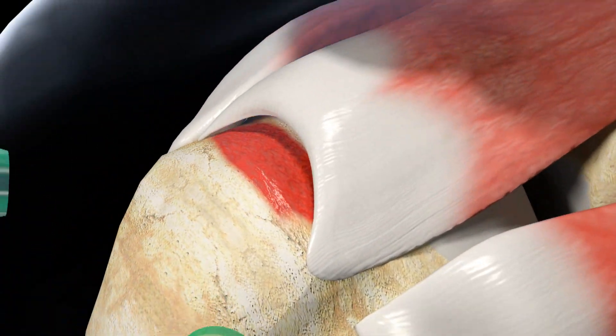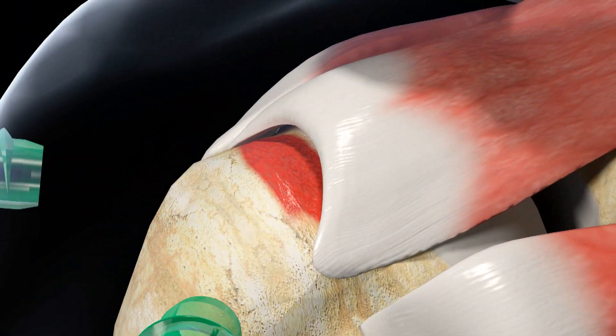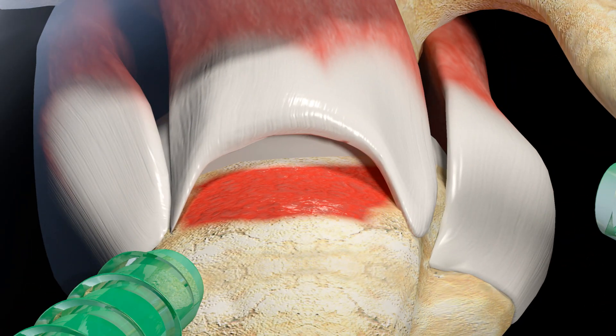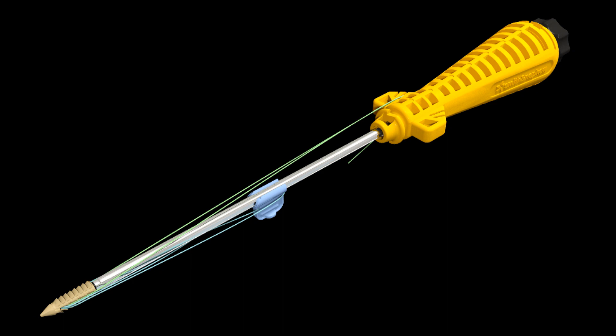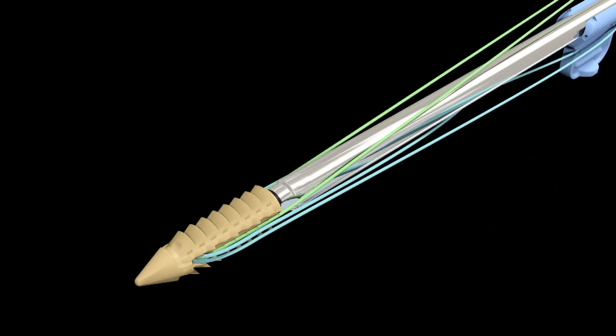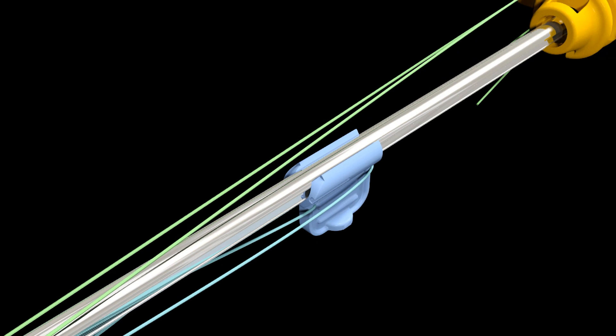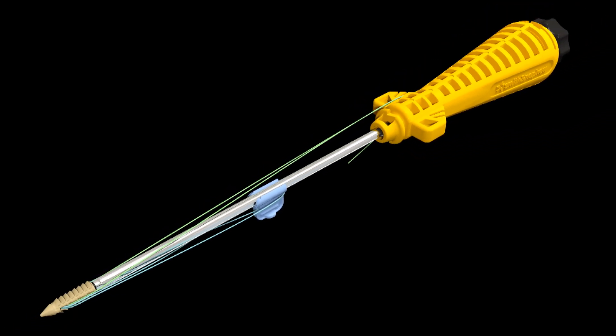In preparation, a bursectomy is performed and the mobility and nature of the tear are assessed. This double row repair will utilize four Footprint Ultra PK suture anchors — two medially and two laterally.